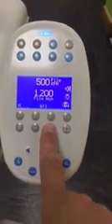And then the final mode will be auto forward. So again, I'll click myself into the menu, move down with the chair arrows and then across, and then use my plus and minus to adjust. So now I've got an arrow backwards and forward, and what will happen in this mode is you'll get a warning beep as you approach 1.2 Newton centimetres of torque. As you hit 1.2 Newton centimetres of torque, you will then get two beeps. The file will stop, start to reverse, and then it will start automatically moving forward again for you. So that is the auto forward mode.